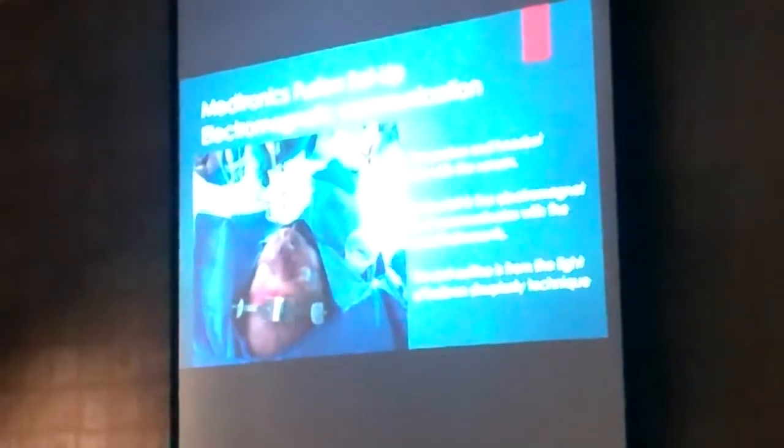So now let's talk about the setup. How do we translate? The image guidance is, I have a device on my patient, and they have a CT scan that was taken with a particular protocol, so that when I put my instruments into the nose, it shows me on the CT scan where we are.